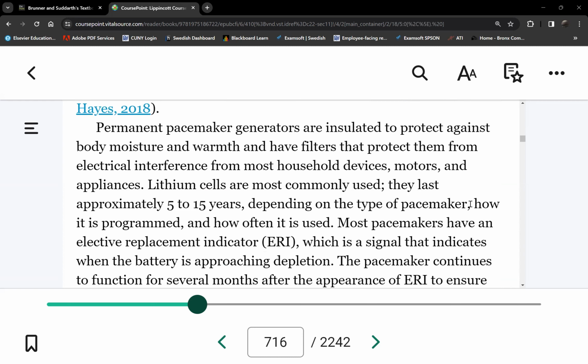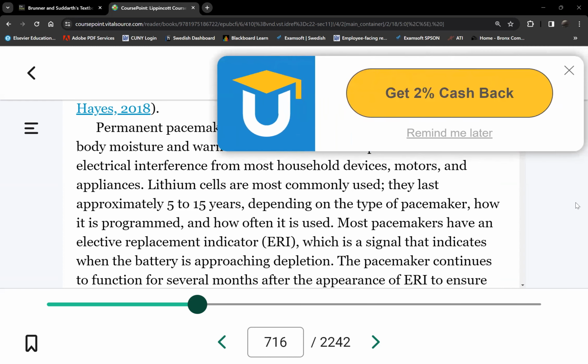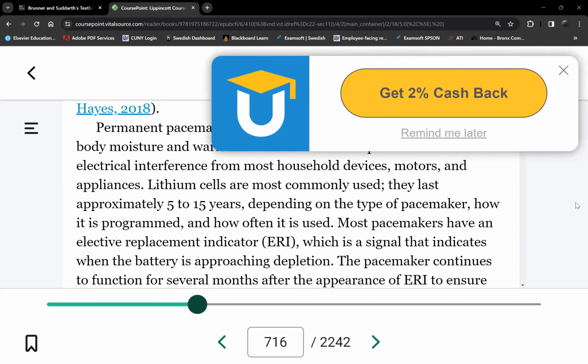So they put the wires into like a catheter? No, the wire goes through the patient's skin, so we'll just tape it, and then they carry the external pacemaker.